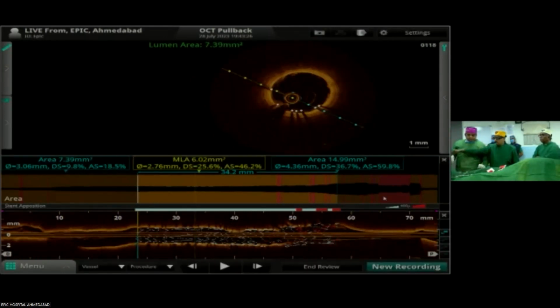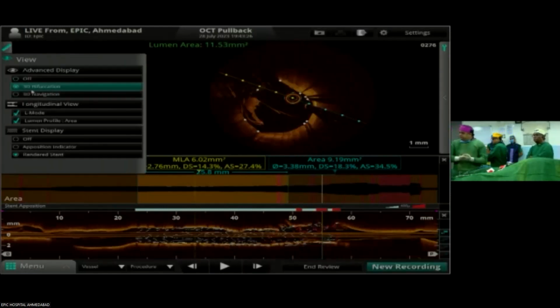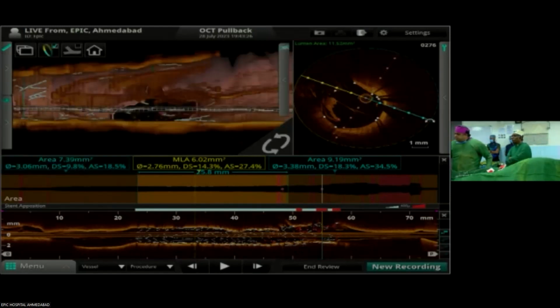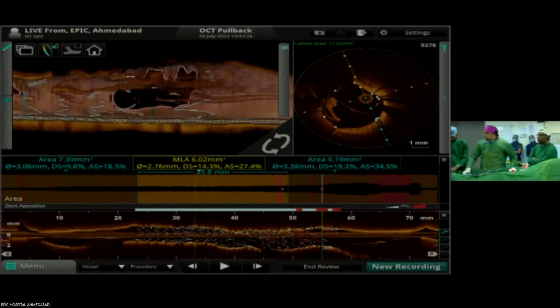That makes people think, number one. Number two, a complicated case, rewiring, if there is a plaque shift, all those things get into the mind. As Rashid told, always do the safer, easier way. Multiple manipulations are not required. Single crossover, proximal part, dilate very well and keep the stent post in the LMCA will make our life easier.